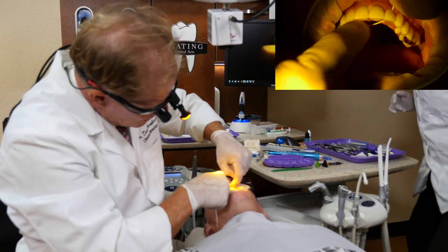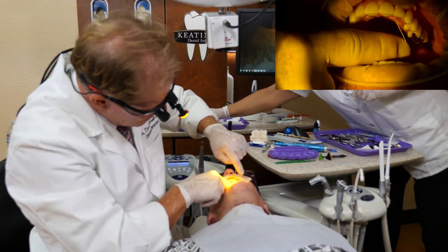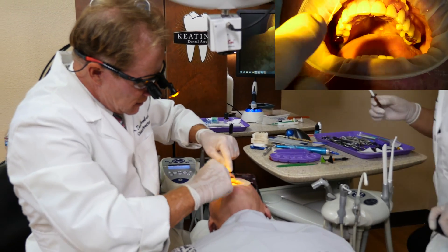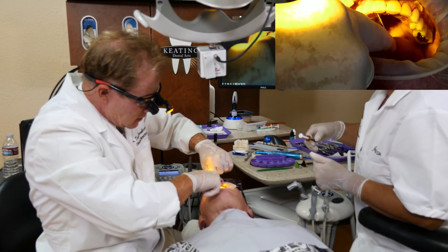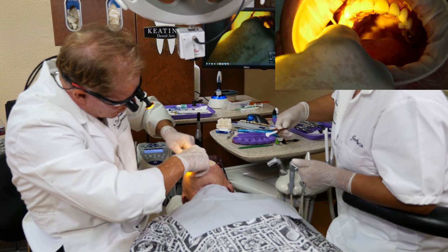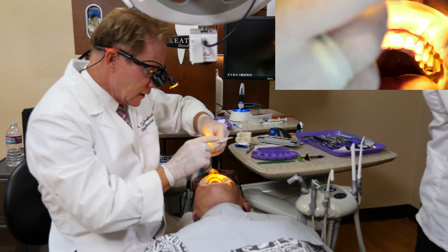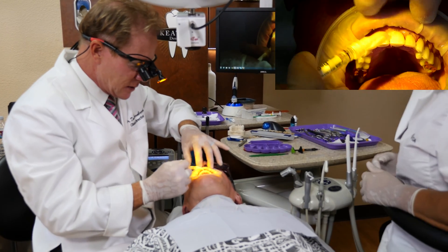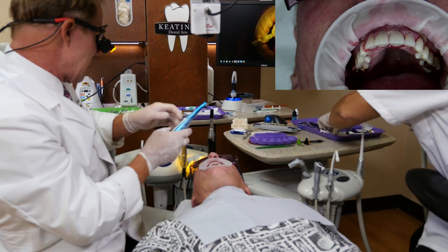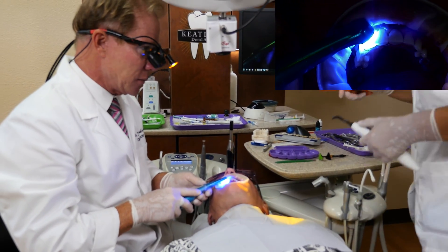Next will be Deox. This hasn't been fully cured yet — they're just tacked. We're going to go ahead and use a glycerin or oxygen inhibition medium. This happens to be Deox — D-E-O-X — from Multident. We put it around all the margins and then we're going to cure with both lights. Since this is a light cure only, I'm going to cure for at least 40 seconds per tooth, both facially and lingually.